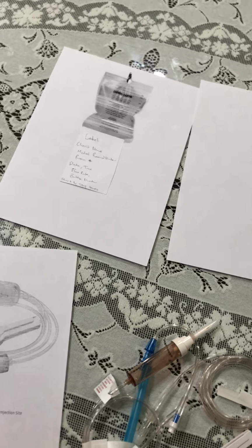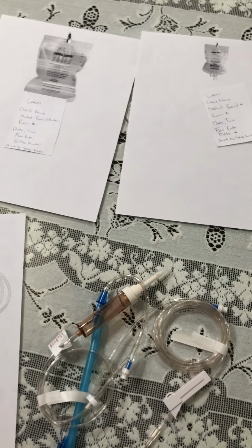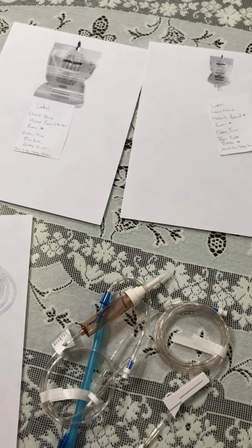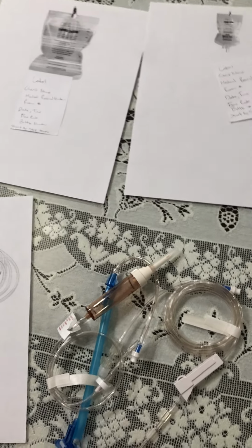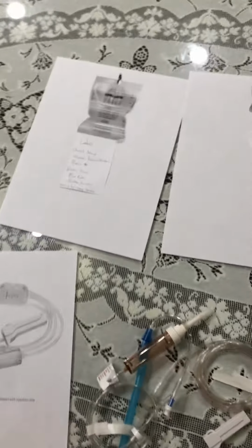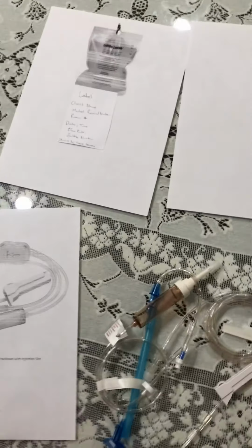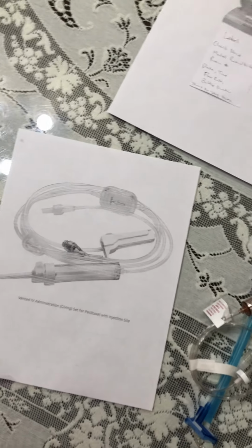So, before I begin, I want to get a set of vital signs just to get a baseline of his vitals. This is going to be helpful because I'm going to be needing this in case complications arise, like adverse reactions to the lipids, or sepsis. So I need to get blood pressure, heart rate, respirations, temperature, and all that. And again, assess my patient's weight before I begin.